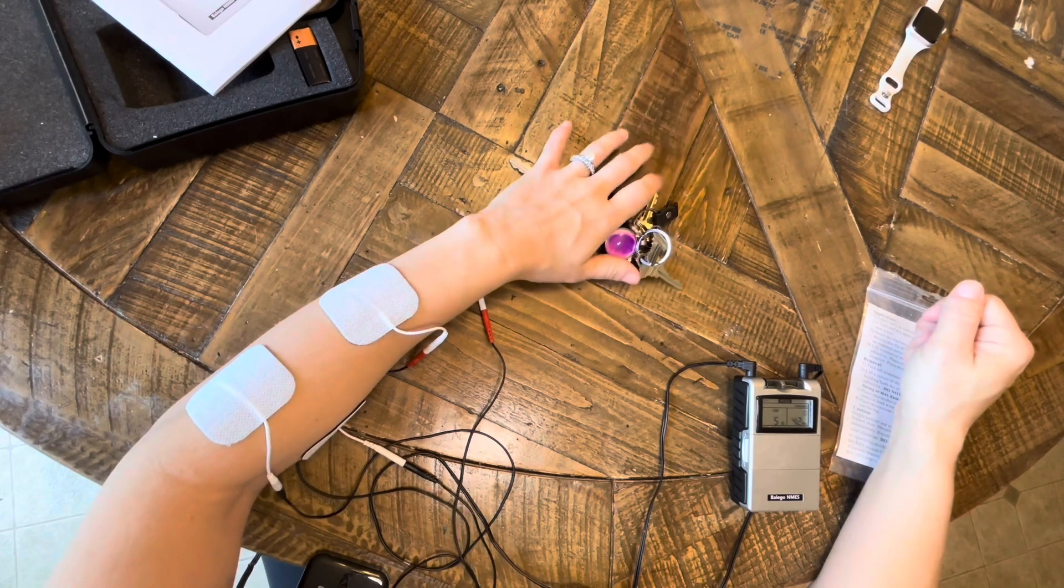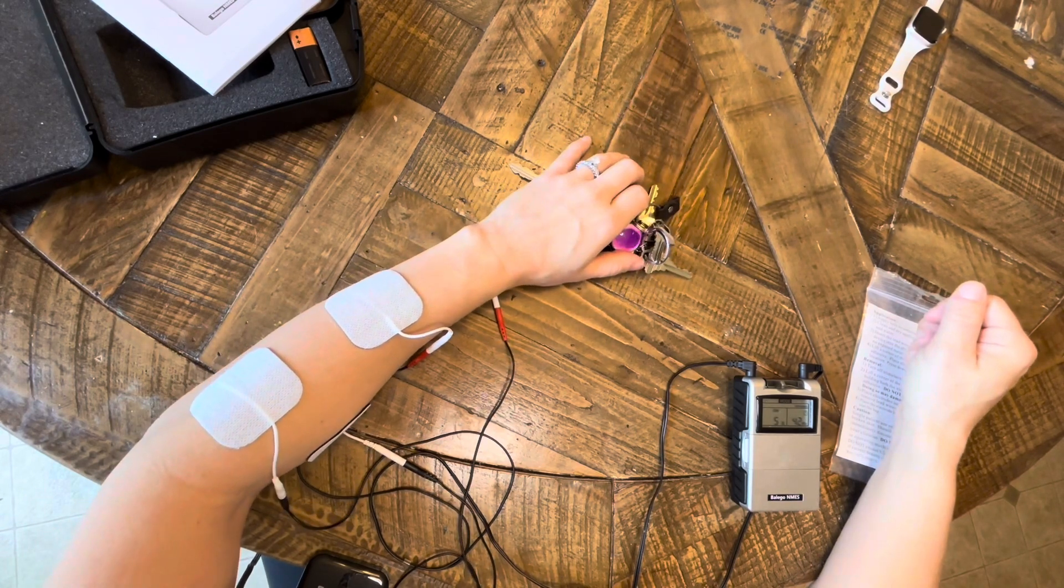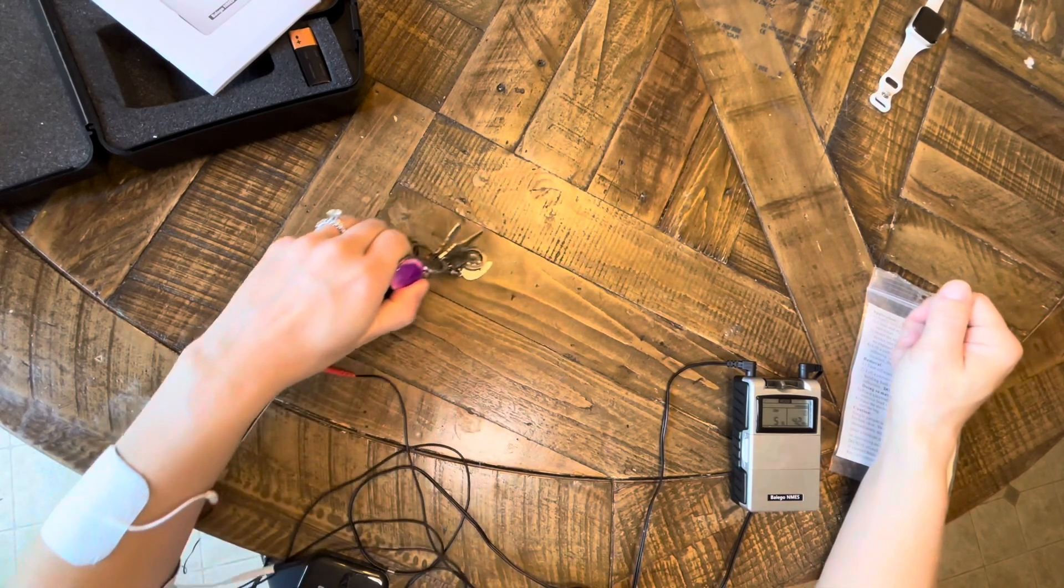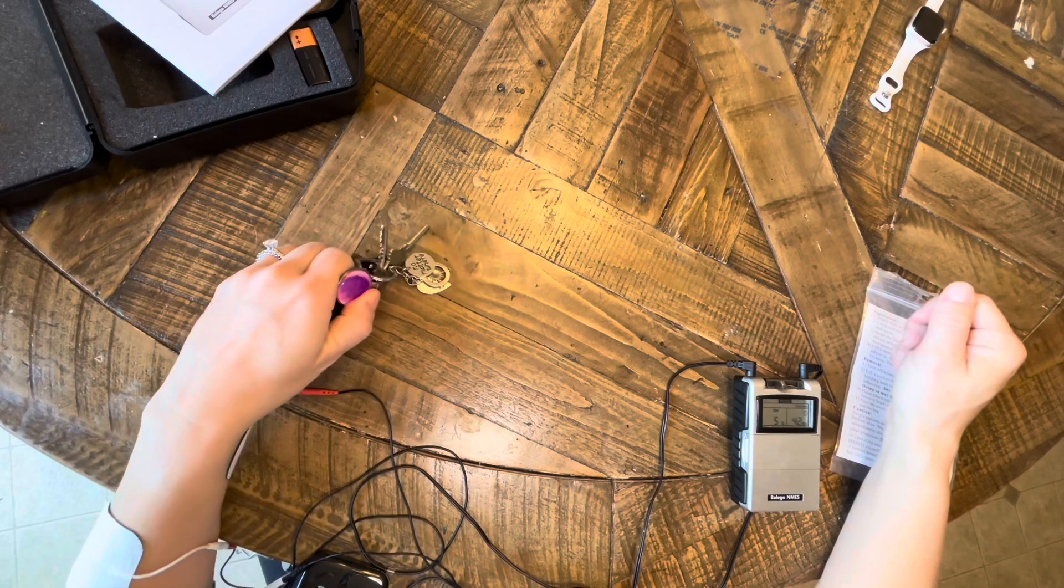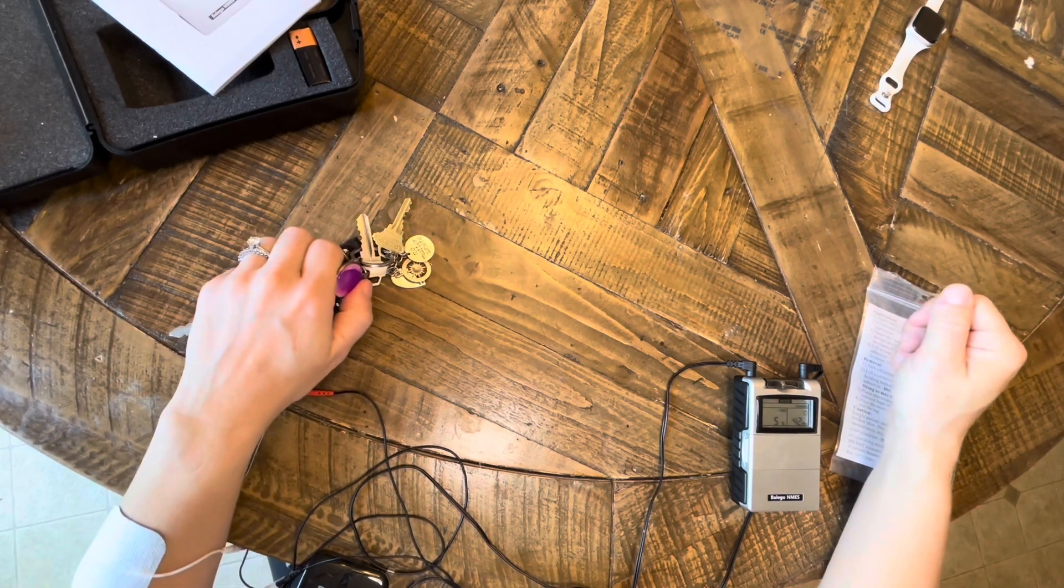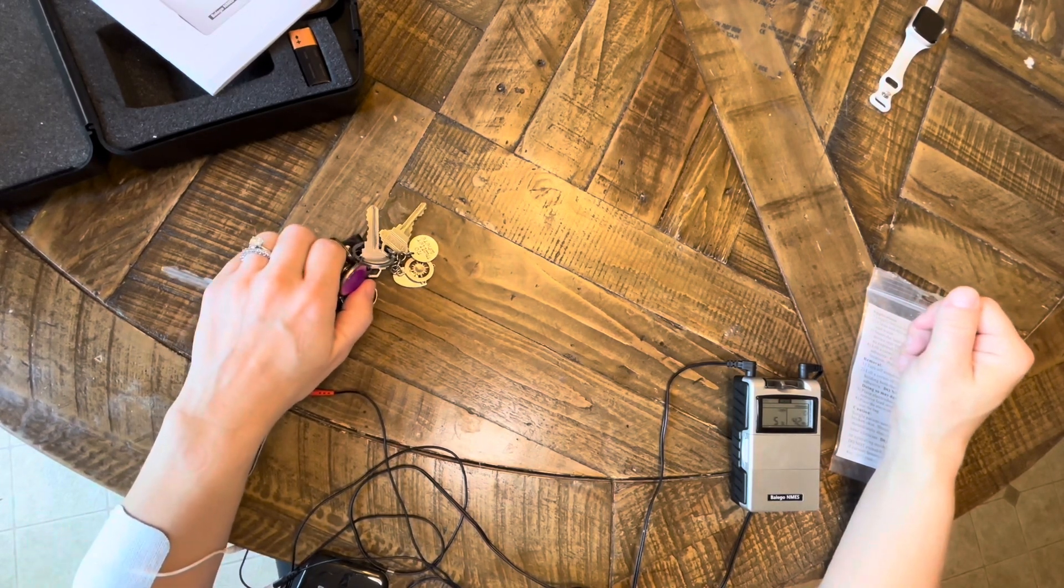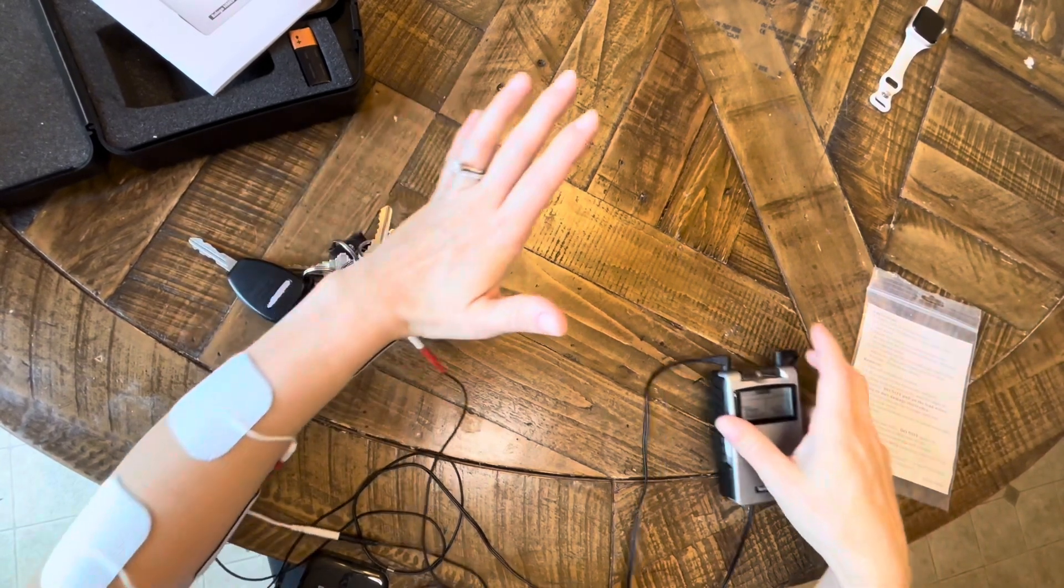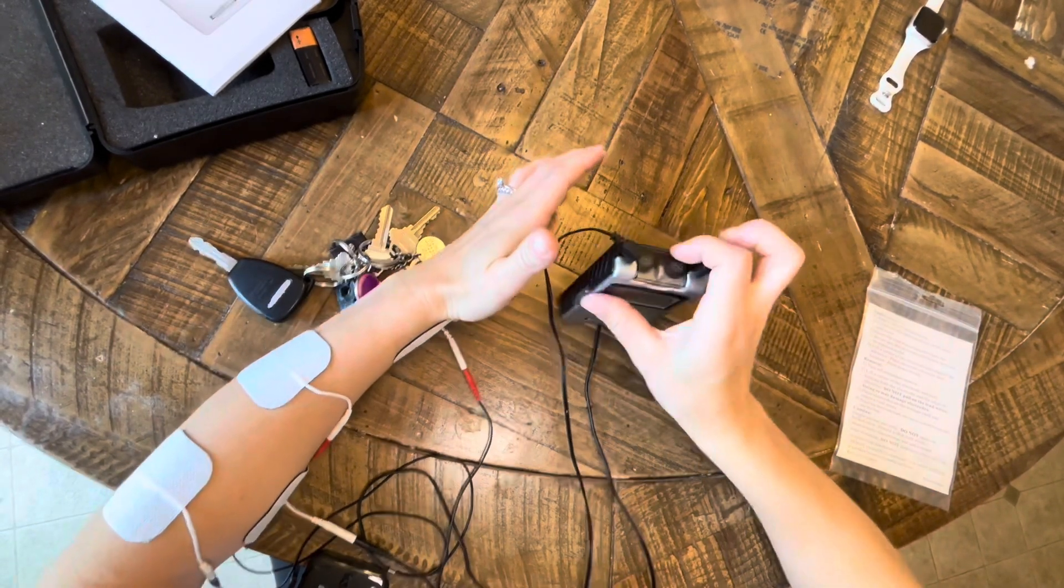Just the whole point is having that arm move, building into a functional activity that's meaningful to your patient, and getting maximal repetitions in to promote that neuroplasticity.